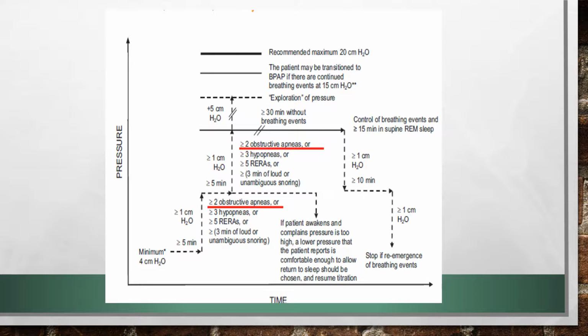You'll see it says 4 centimeters of H2O minimum. So that's our minimum starting pressure. Again, you can start a little higher, especially with morbidly obese patients. Sometimes they just need more pressure, but the minimum pressure you can start with is 4.